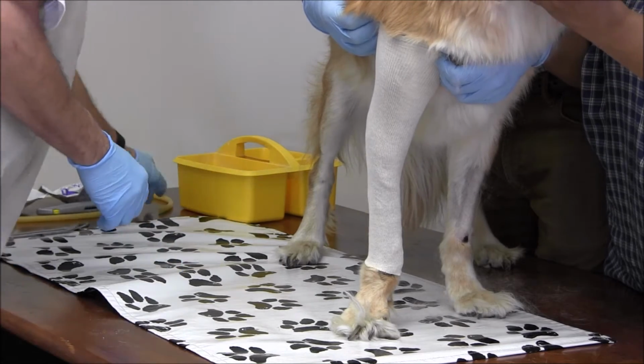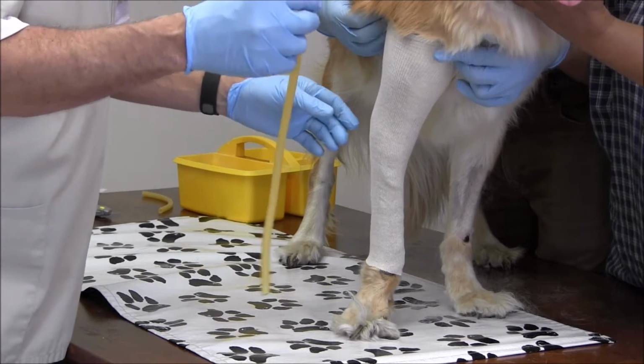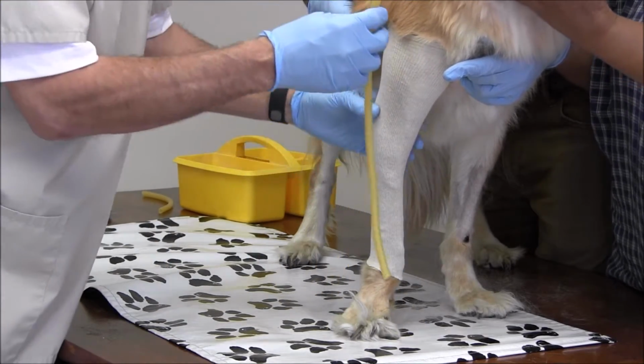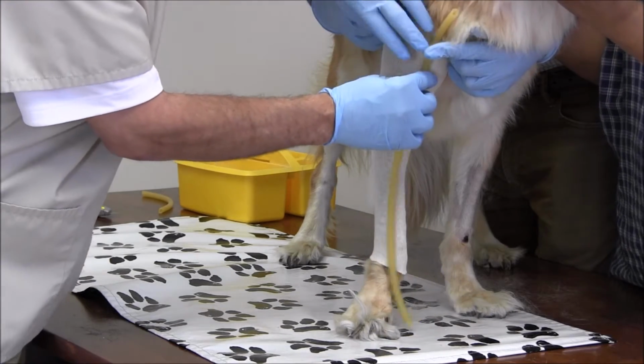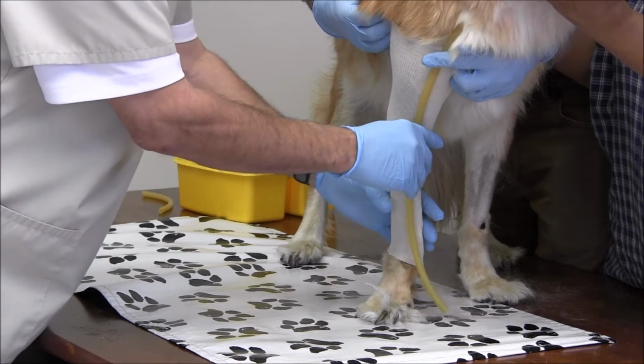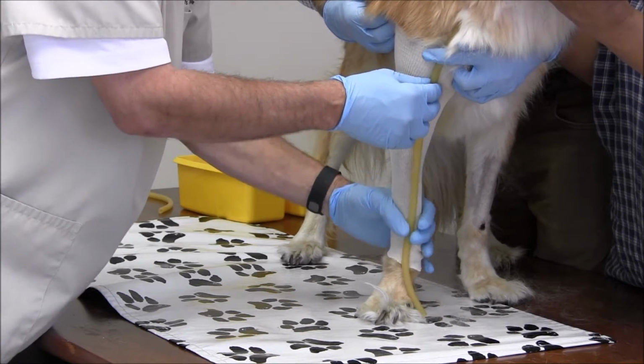And then we need a cutting strip in order to be able to take the cast off, so we can cut on the cutting strip. We're going to use a piece of surgical tubing. That surgical tubing is going to go cranially towards the front, and we're going to have it all the way up on top of the axilla down to the carpus.